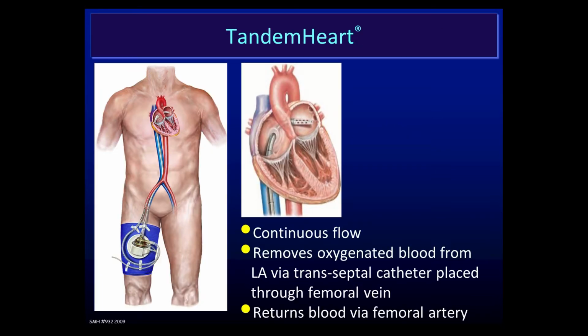Here's the TandemHeart. I'm coming from Hackensack to Houston to talk about the TandemHeart. Maybe I should have brought my coal, and this is Newcastle. But in any case, this is the TandemHeart. It goes across the interatrial septum. It's a continuous flow device. It's a septal puncture. It takes oxygenated blood out of the left atrium, and it pumps it back through the femoral artery into the heart, and thus does partial work of the heart.